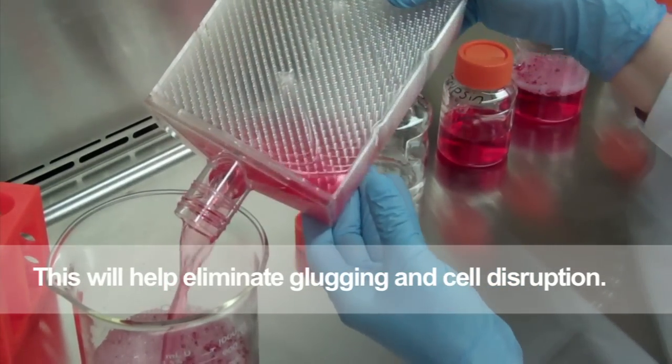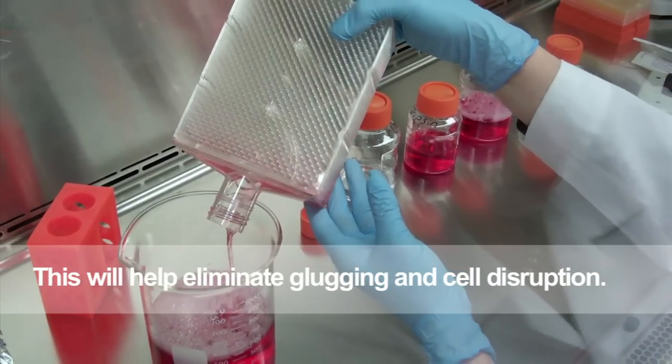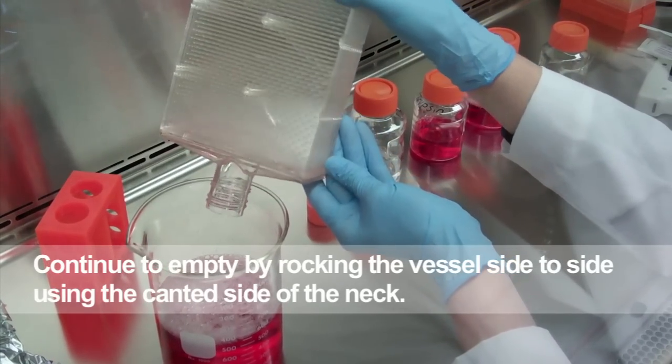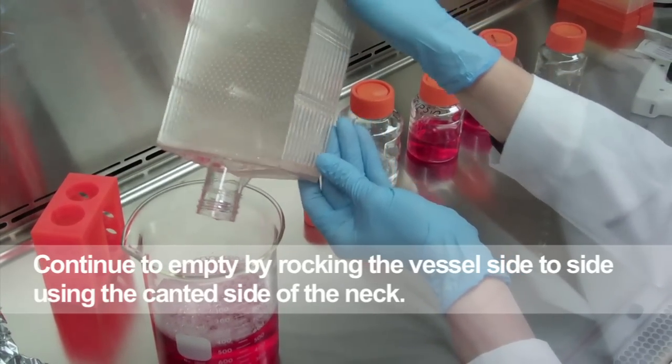This will allow the liquid to move out smoothly and eliminate any glugging that may disturb and pull your cells off of the surface. Continue to empty by rocking the vessel back and forth using the canted side of the neck.